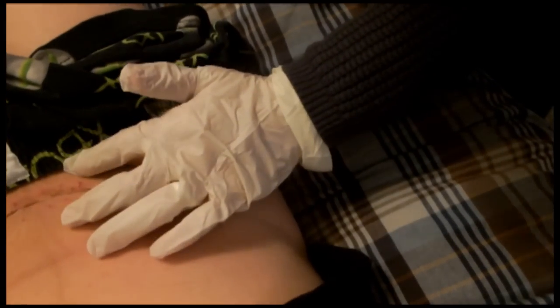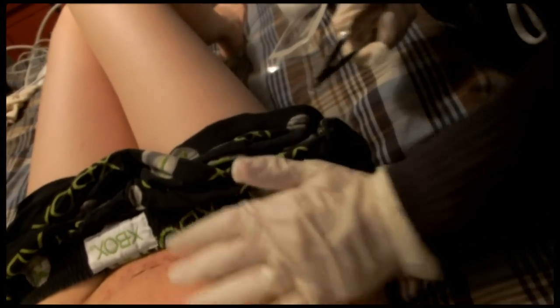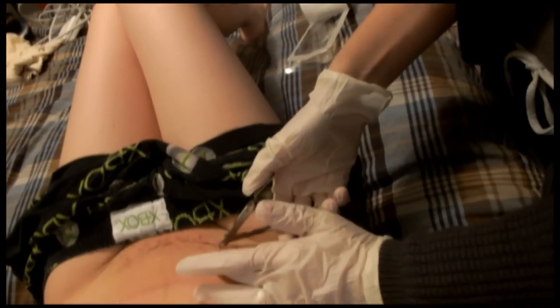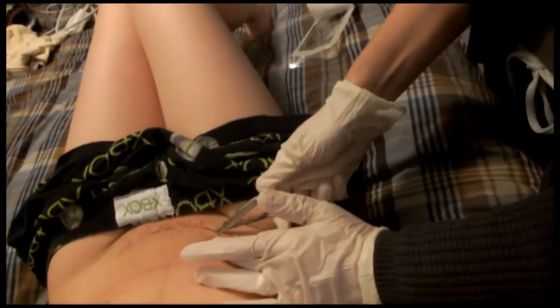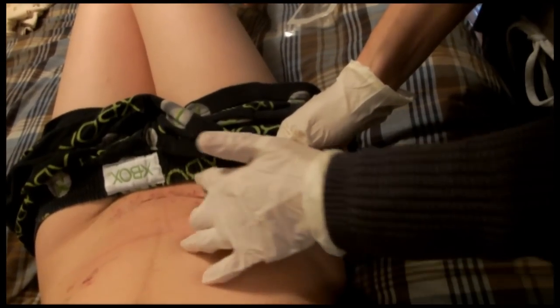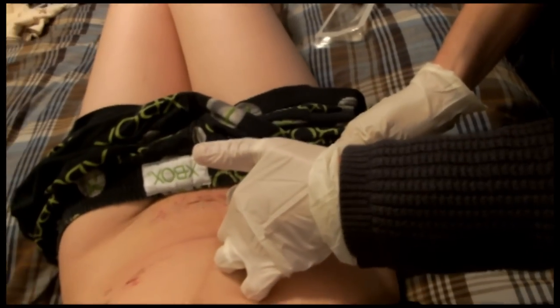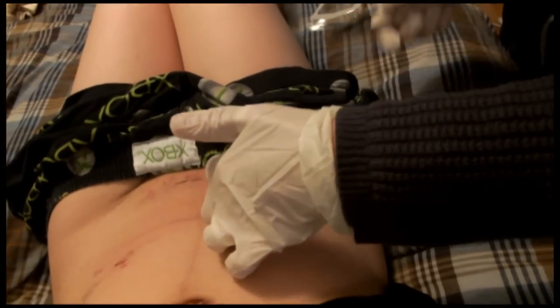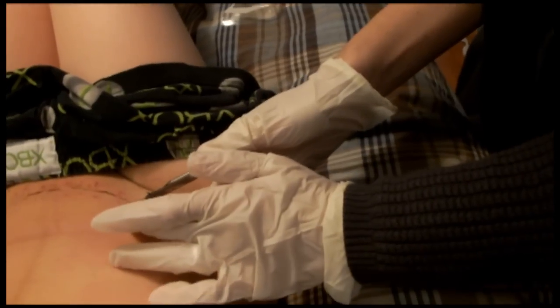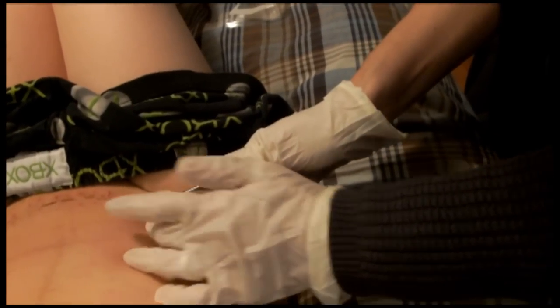Here's the skin separating a little bit. Oh no. It's okay. Is it going to hurt again now? I don't think this one's going to hurt as much. It's a little more red on the edge, so it might hurt a little bit. Oh my gosh. Okay, are we done? Are we done? This is the last one. The skin doesn't look as pink over here, so I don't think it's going to be as painful.